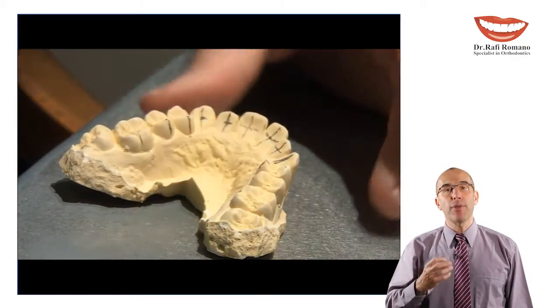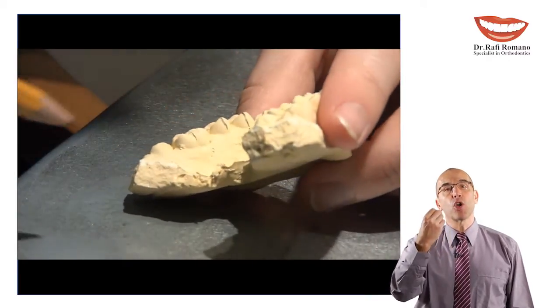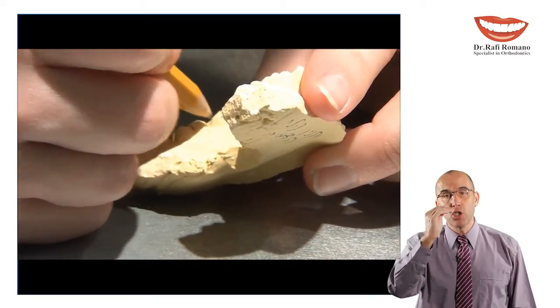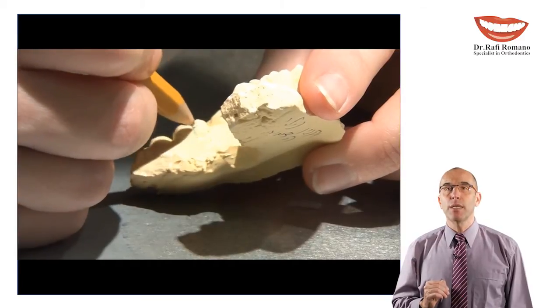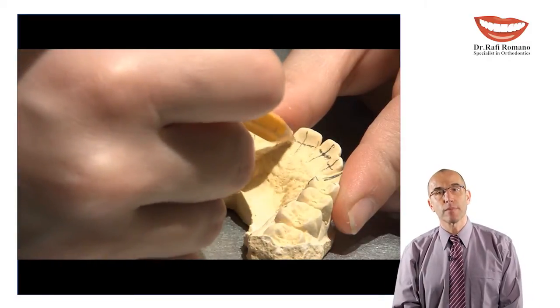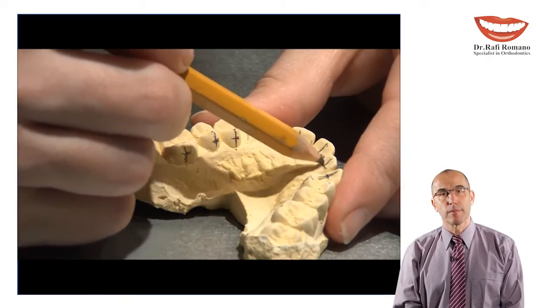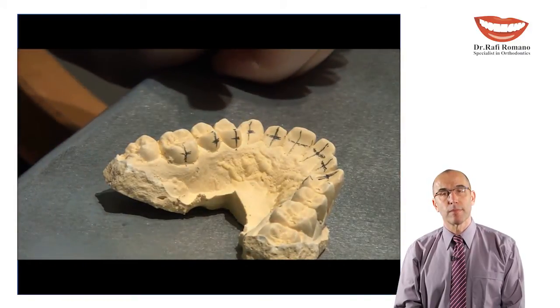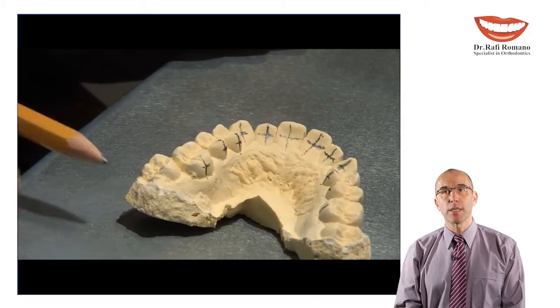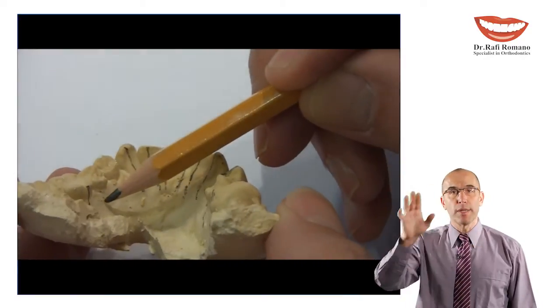When I want to have a minimum movement of teeth and more control, and to get closer to the center of resistance of the tooth, I will try to locate the bracket more gingivally. And you can see here we do it one by one on all the teeth. Here you can compare this cross that we got for all the teeth.